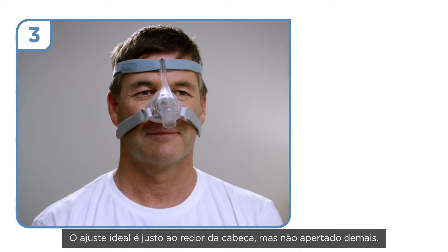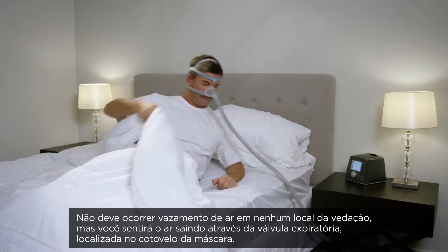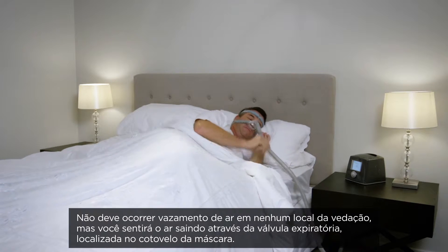A good fit is snug around the head, but not too tight. There should not be any air exiting the mask around the seal, but you will feel air coming out of the exhaust at the front of the mask frame.